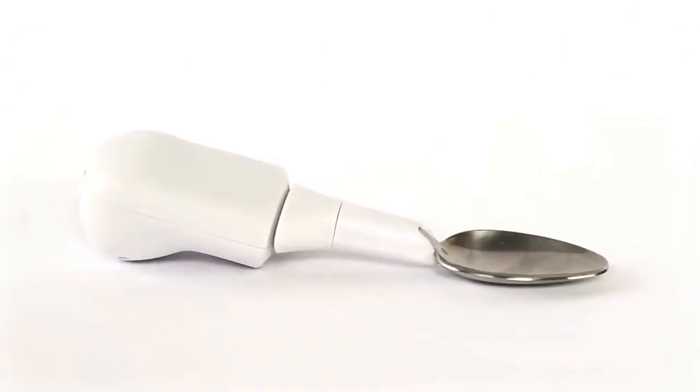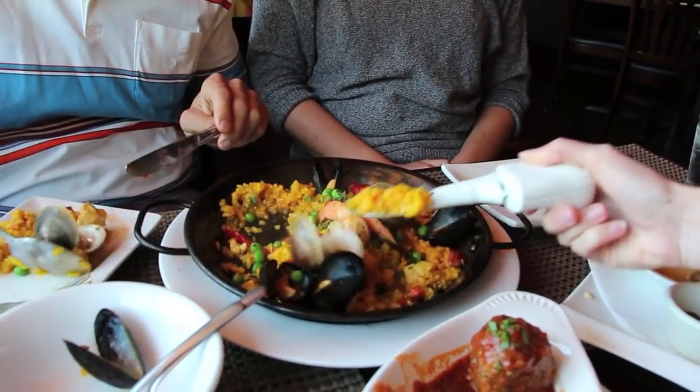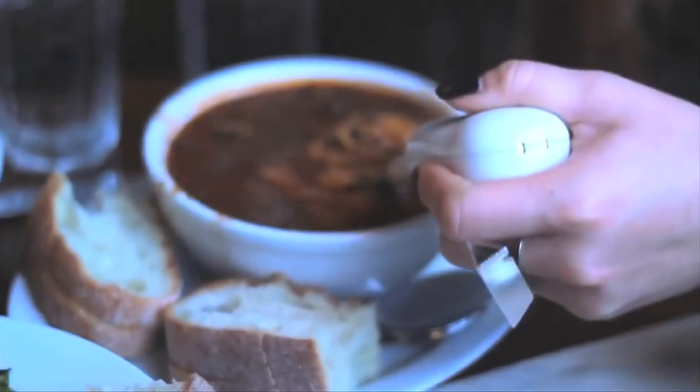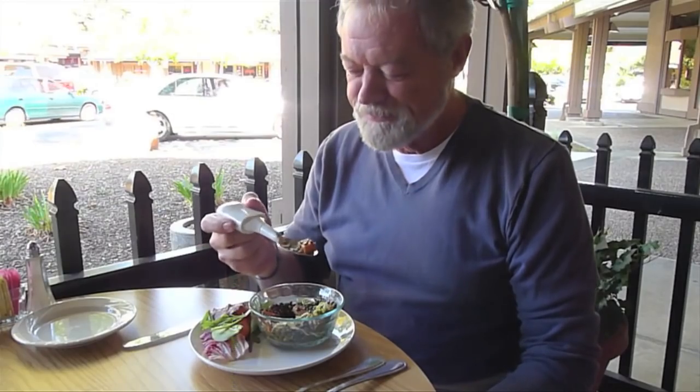We're proud to offer a product that allows people to take control of their tremor. When you eat with Liftware, your tremor retreats into the background of the meal so you can focus on the best parts of dining — the food you're eating and the people you're eating with. We can't wait to bring Liftware to your life!